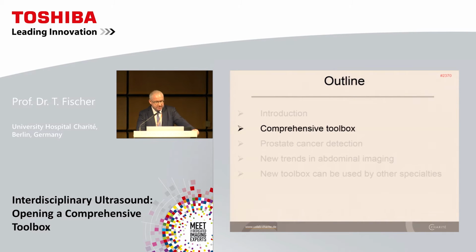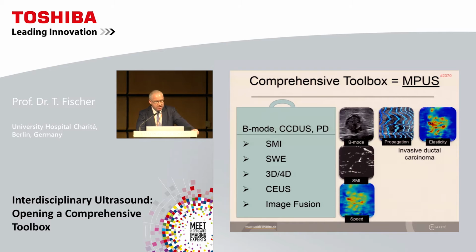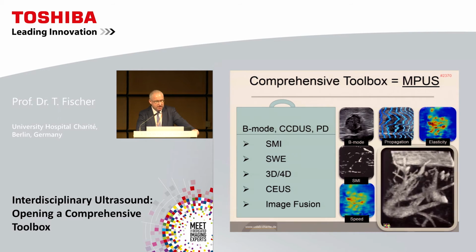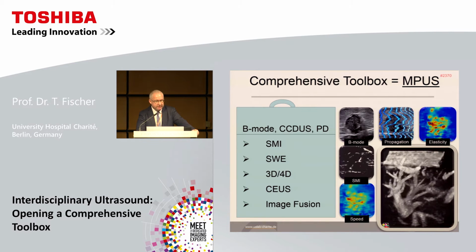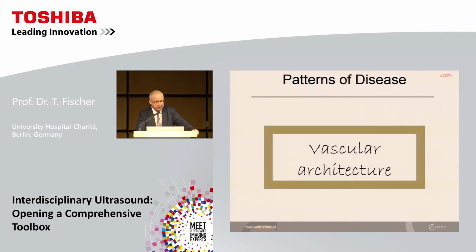Coming to the comprehensive toolbox, what does it mean? In my opinion, it's a translation to multi-parametric ultrasound imaging. And we have a lot of new tools, and of course, I have to explain this more in clinical detail.